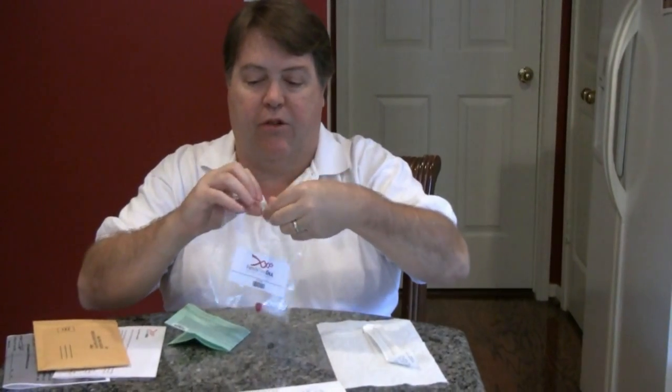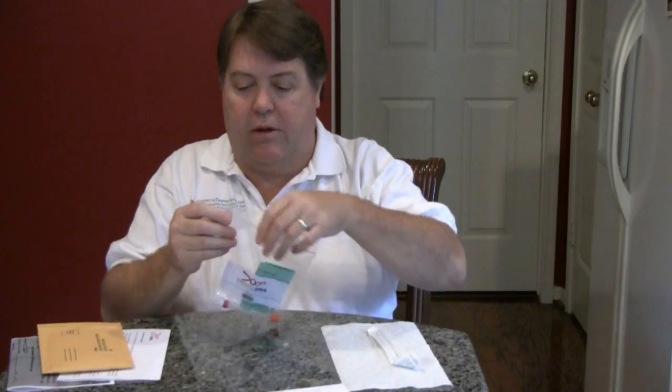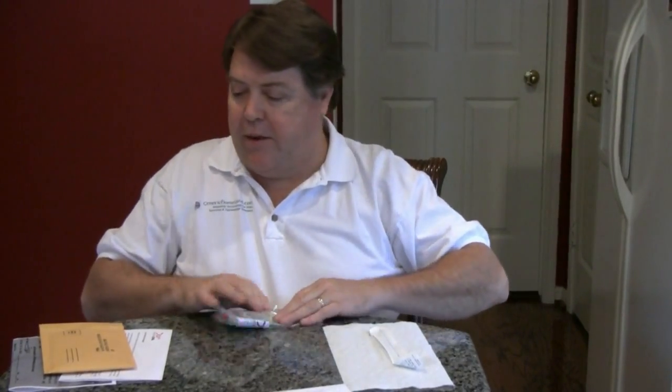So when we finish swabbing both cheeks and get our vials put back together, be sure the vials are inside the plastic envelope — it has your test kit number on it. Place the release form that you signed in the back as well. Press the air out and seal it up.